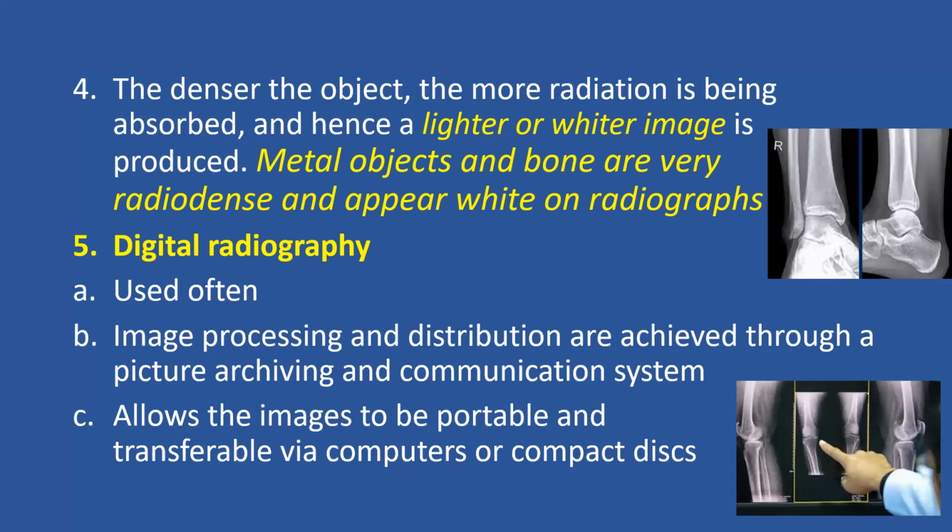With radiology, we have created digital radiography. A lot of the treatments, a lot of the X-rays, a lot of projections occur on X-rays to individuals. And digital radiography was created, and it is used often. Image processing and distribution are achieved through a picture archiving and communication system.